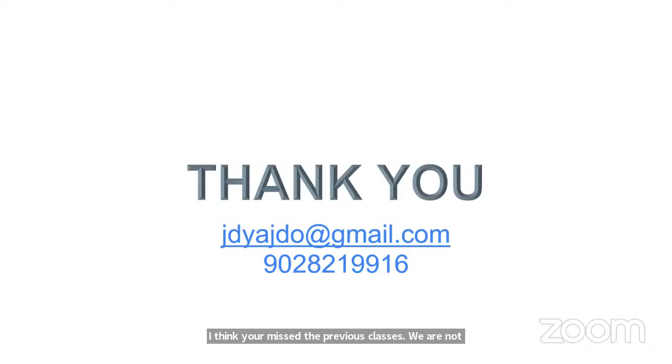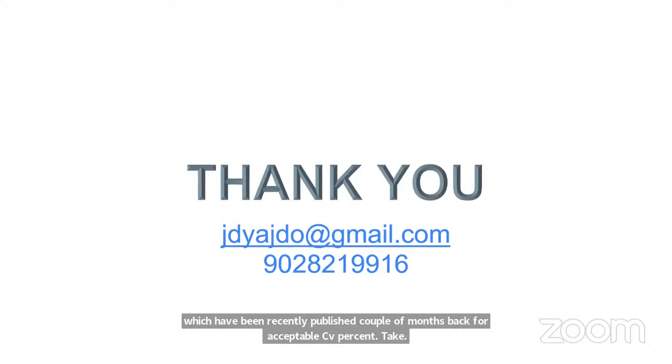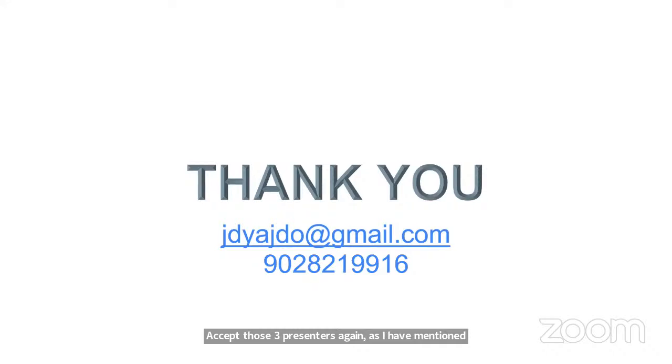How much data is sufficient for setting the lab mean for a new lot of QC? At least 20 samples should be used for lab mean setting. Okay, so please fill the feedback. How much percent CV is considered for IQC? As I have mentioned, please follow the CLIA 2024 guidelines, which have been recently published a couple of months back, for acceptable CV percentage. They are freely available. You can download them.